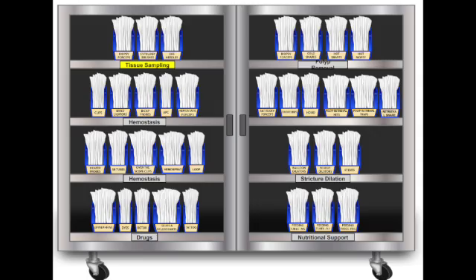And it has a role in removing tissue, too, like EMR. Absolutely. This is where it gets quite advanced. For endoscopic mucosal resection, or EMR, you can use the bander to suck up the target tissue, maybe Barrett's esophagus, early cancer, create a pseudopolyp, band it, and then snare it off above the band. So it helps lift the tissue for safer cutting. Exactly. Also used effectively for removing certain carcinoid tumors, especially in the rectum.